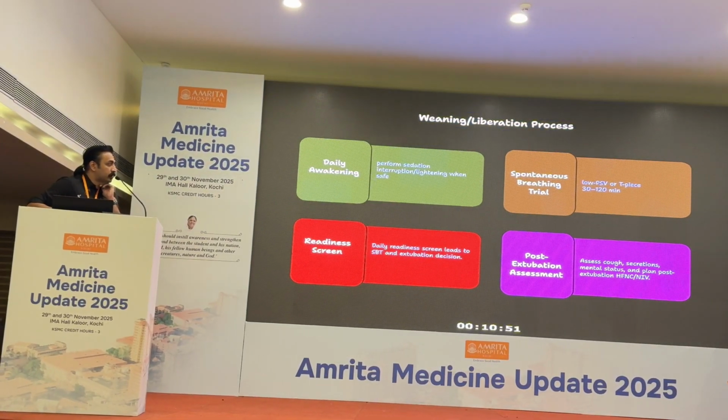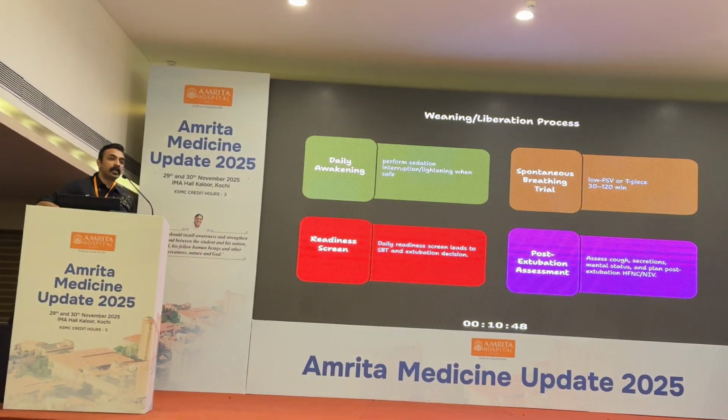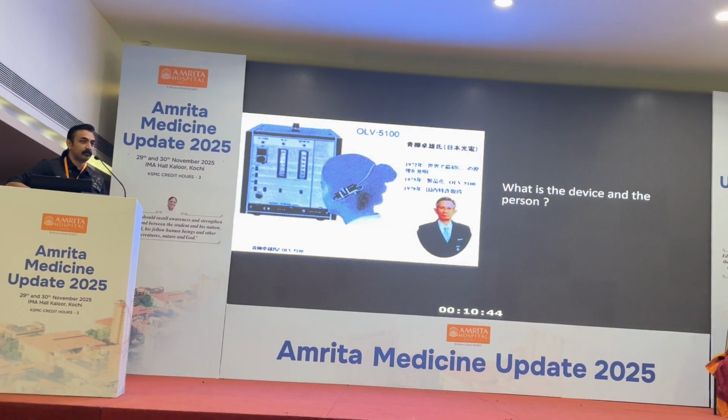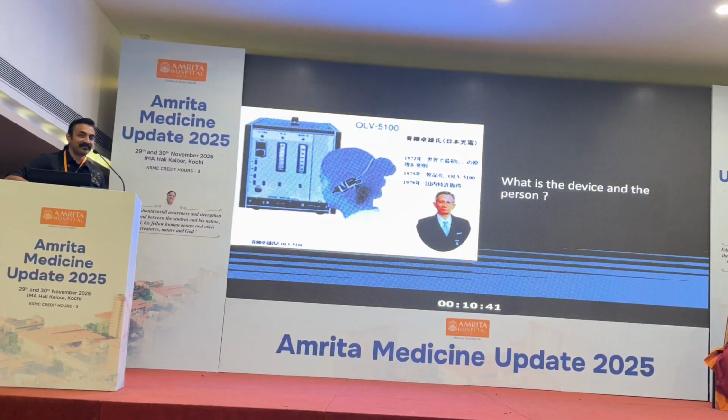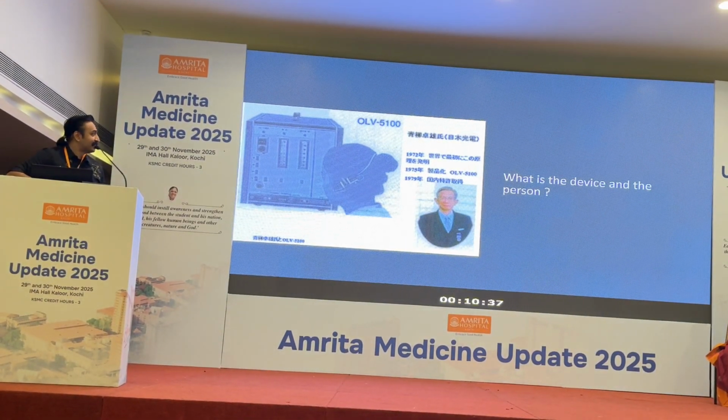And post extubation, always assess for cough, secretions, mental status, and plan post extubation support with an HFNC or NIV if needed, right? Okay, the last question for residents, what are you seeing here?